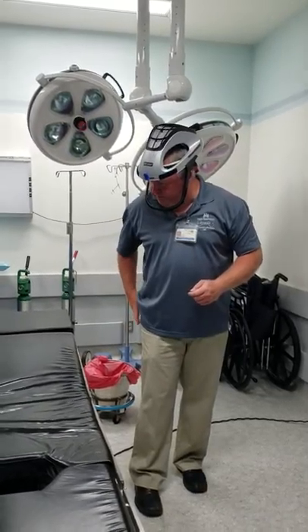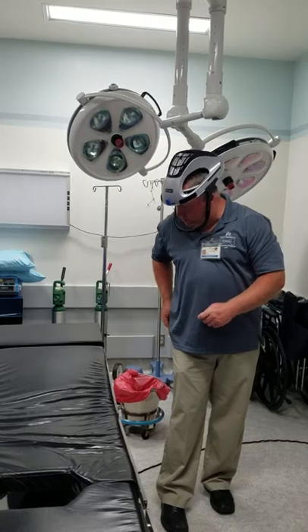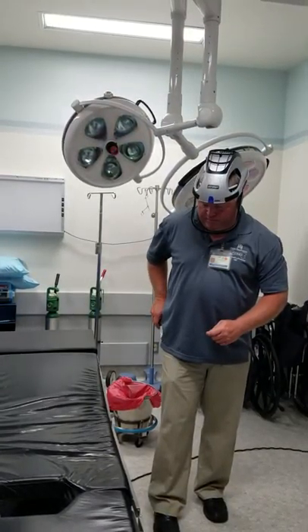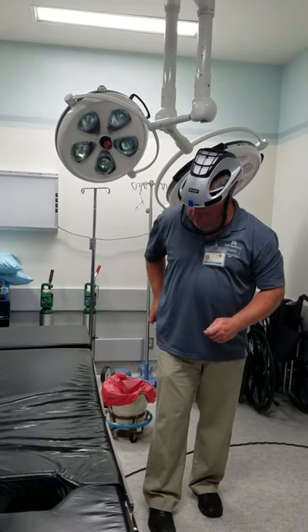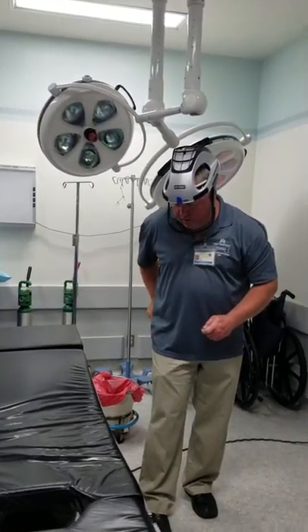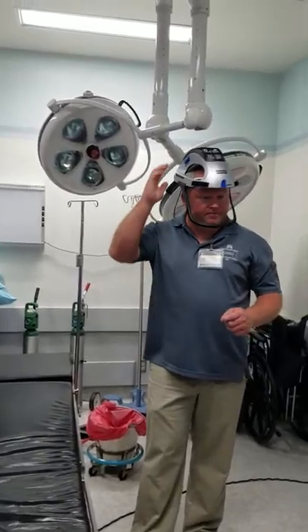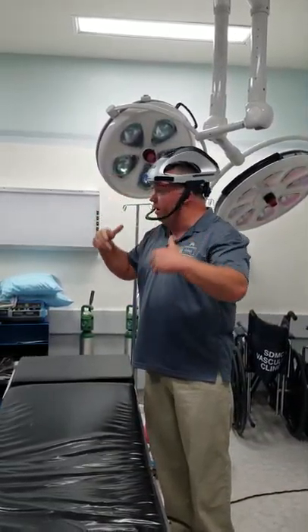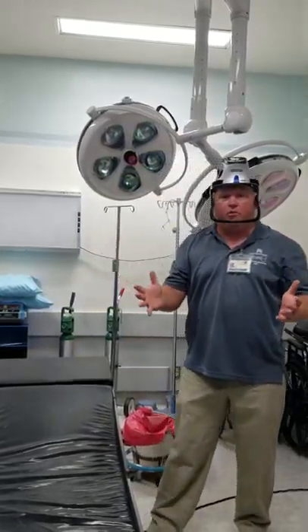This is the hood. You're going to plug that in — make sure it's plugging all the way. It's going to blow air on you, so it's a cool — it can get pretty hot. Now we're going to scrub our hands. What are we going to do? If it's the first scrub, we do the full scrub. After the first scrub, we use the gel.